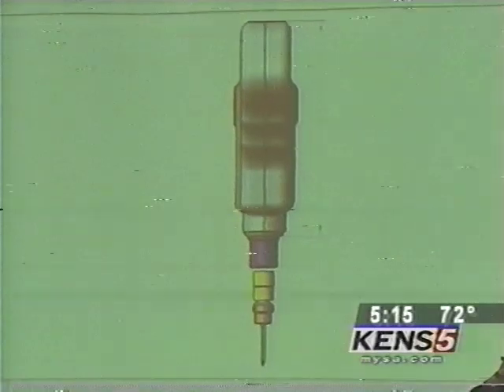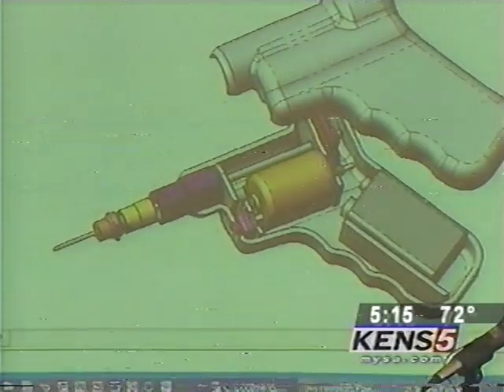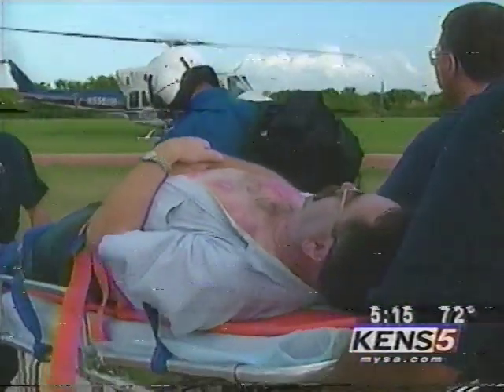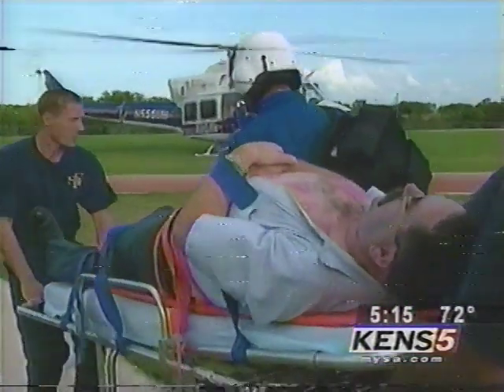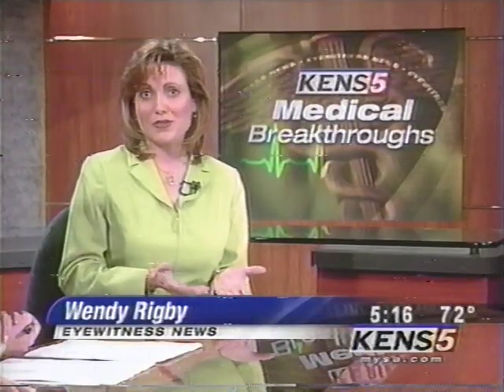Dr. Larry Miller and the designers of VidaPort will spend the next 2 months fine-tuning the engineering. FDA approval is expected by August, and the VidaPort could be on the market by the end of the year, speeding critical care to patients who need it most. When I place this into the bone, I get central line access in seconds, so my medications are on board quicker. The VidaPort driver will cost about $150, with the needles costing about $95 each.